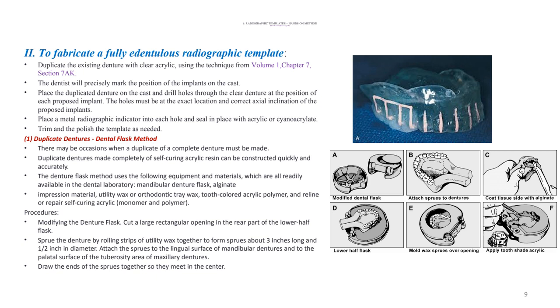We can see in the pictures, in picture A, where the patient has the missing teeth. We use denture teeth and place them in the diagnostic cast to mimic how the patient is going to look with the final restoration.